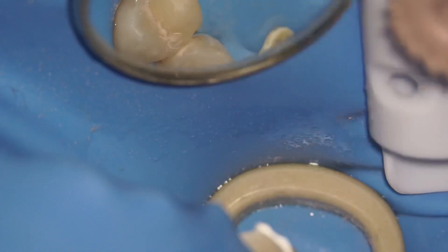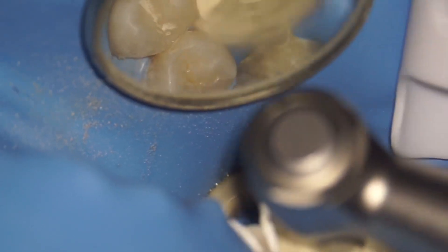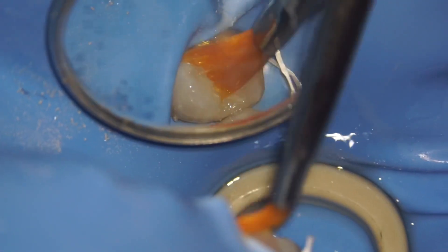You get a very natural-looking tooth, and definitely go ahead and polish it with red and white polishers. To be honest, the polishing makes a load of difference. If you don't trust me, look at the 1,5 and 1,6 in the pictures — that was done one and a half years ago, about 18 months ago, and you can see how well the composite still looks.